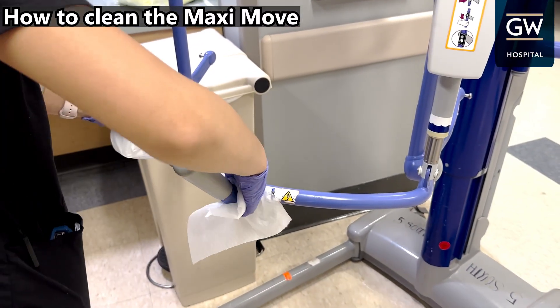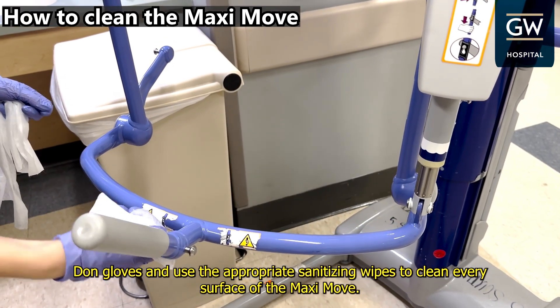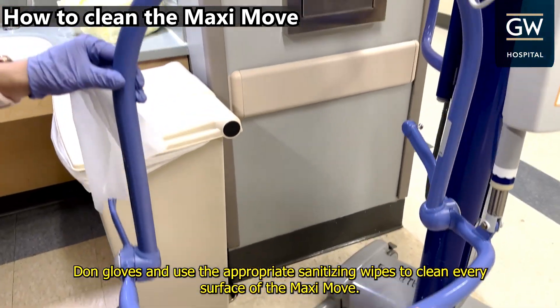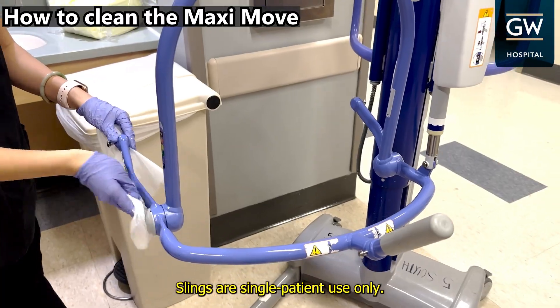How to clean the MaxiMove. Don gloves and use the appropriate sanitizing wipes to clean every surface of the MaxiMove. Slings are single patient use only.